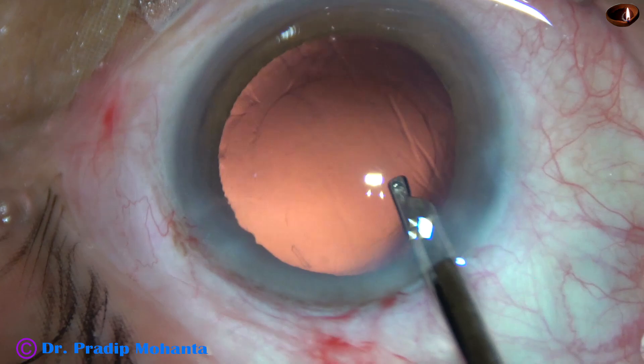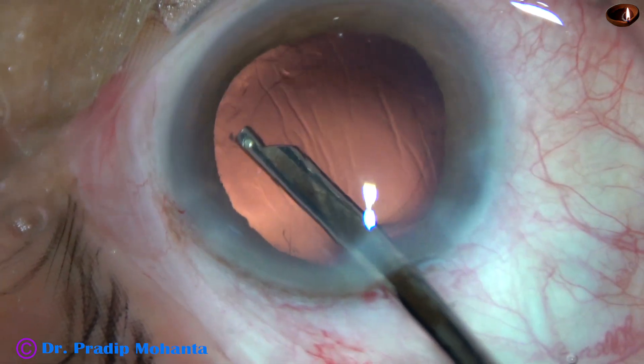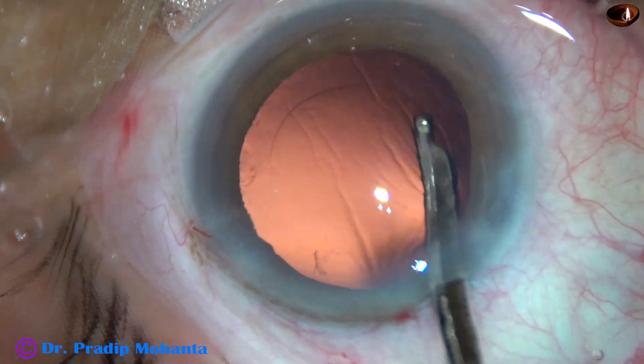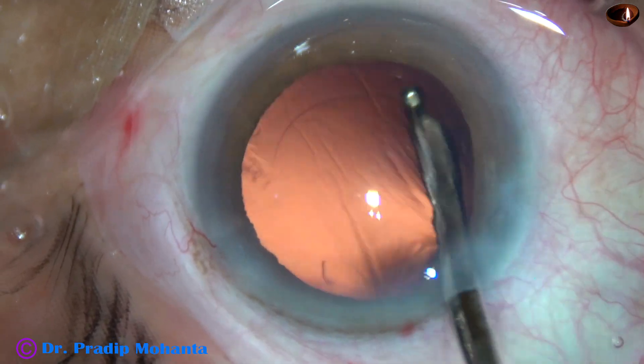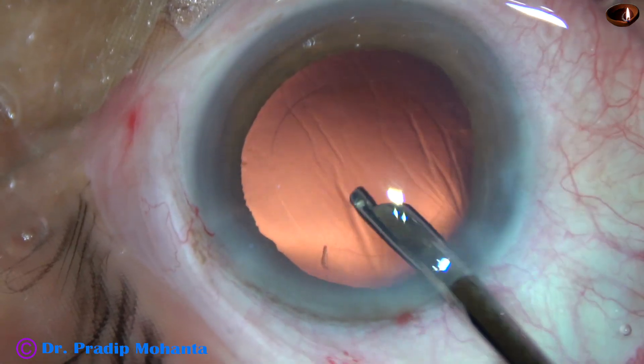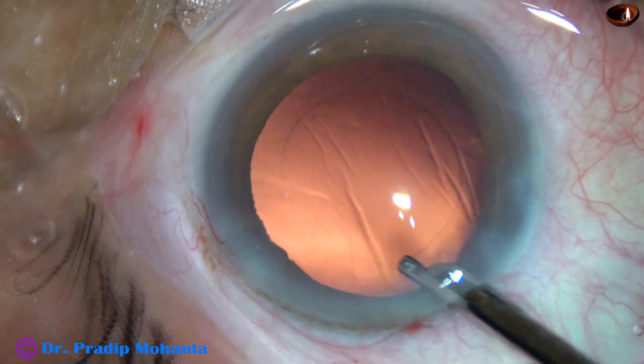And now this is a bit of polishing of the posterior capsule. You can see that the posterior capsule is nicely cleaned.